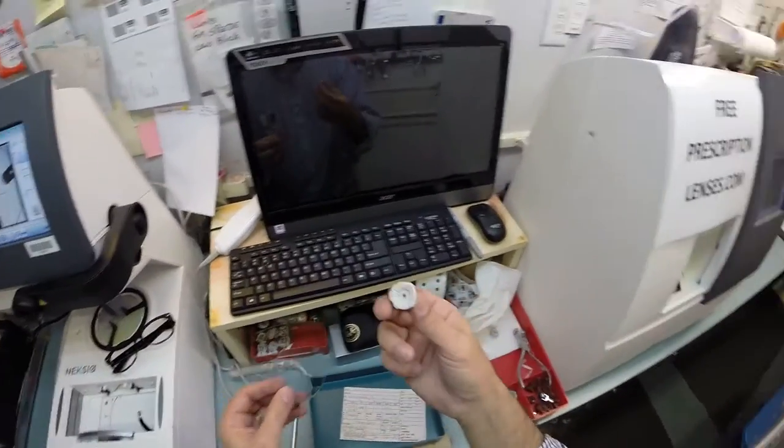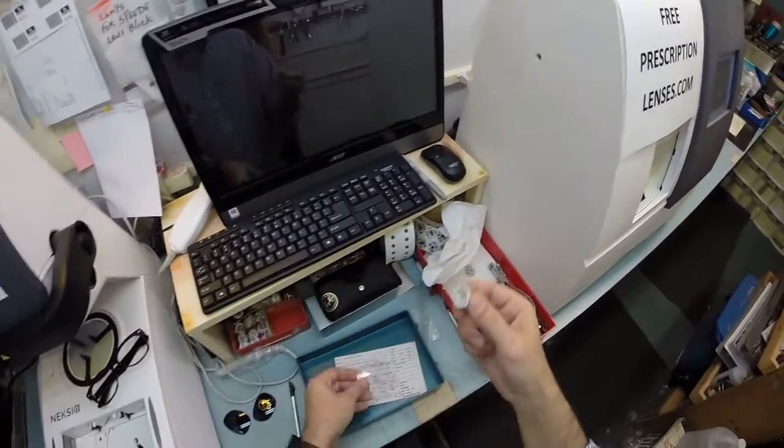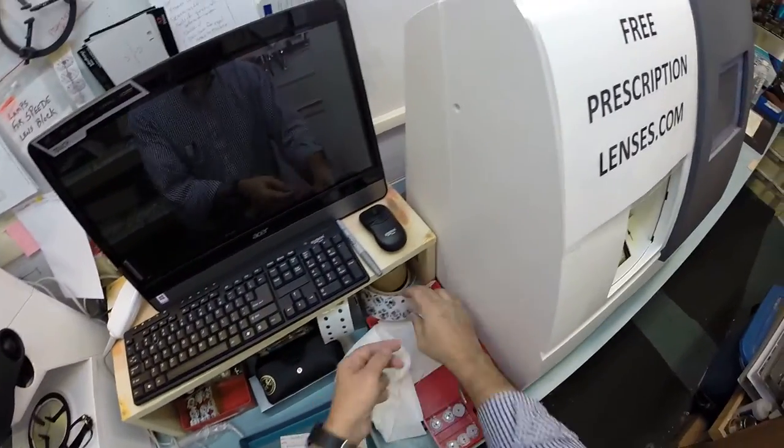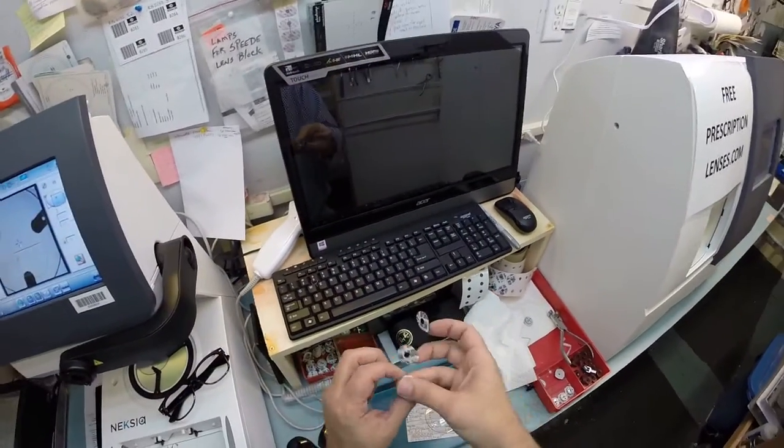Now this is a block. I like to call it Jenny from the block. But this is what attaches to your lens while it is cutting. So I need a double-sided adhesive sticker to apply to the lens to make sure that it will stick on there.